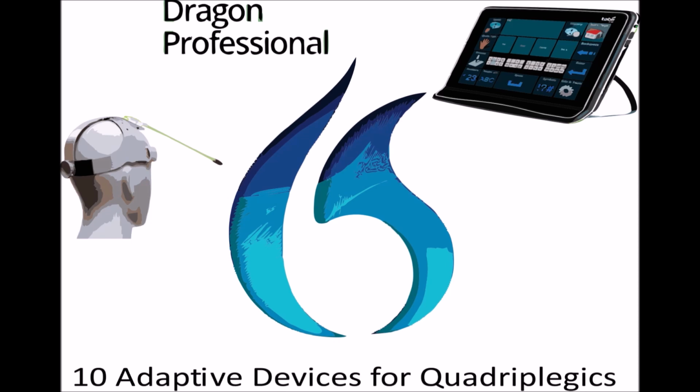Non-invasive systems use cameras or sensors placed near the user's eyes to track their movements. Eye gaze systems can be customized to fit an individual's specific needs and preferences, such as the sensitivity of the system and the type of commands or inputs used. With proper training and practice, individuals can become proficient at using an eye gaze system to interact with their environment and perform a wide range of tasks.